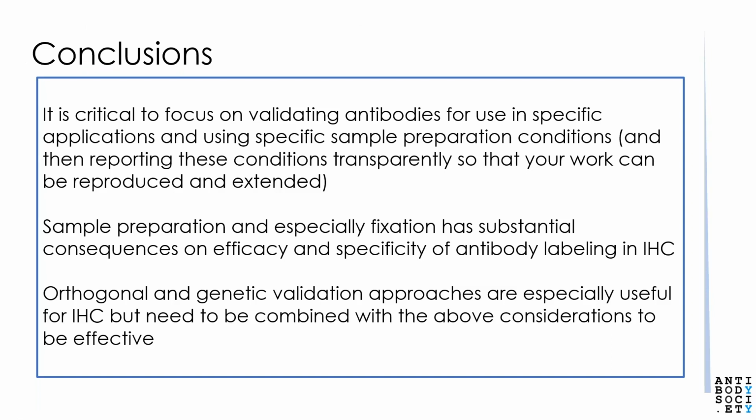In conclusion, it is critical to focus on validating antibodies for use in specific applications and using specific sample preparation conditions, and then reporting these conditions transparently so that your work can be reproduced and extended. Sample preparation and especially fixation has substantial consequences on efficacy and specificity of antibody labeling in IHC, and orthogonal and genetic validation approaches are especially useful for IHC, but need to be combined with these above considerations to be effective. Thank you, and I'm happy to take any questions.